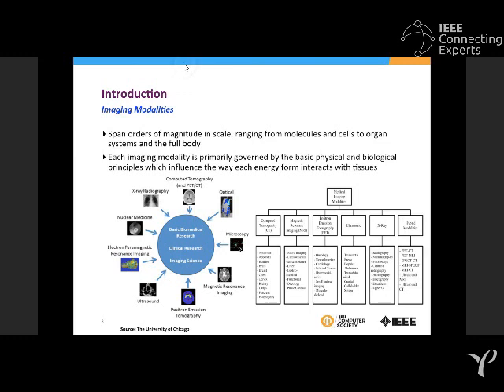That response can be tracked or tomographed to find whether the response is proper or not proper, and that is the most phenomenal way of diagnosing some patches or some disease in the brain, because the brain is mostly composed of, apart from the external hard skull, the internal of the brain is mostly soft tissue. So you see that once I move from the CT to MRI, I am trying to understand different types of organs.